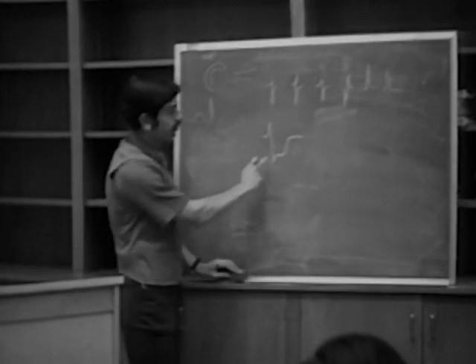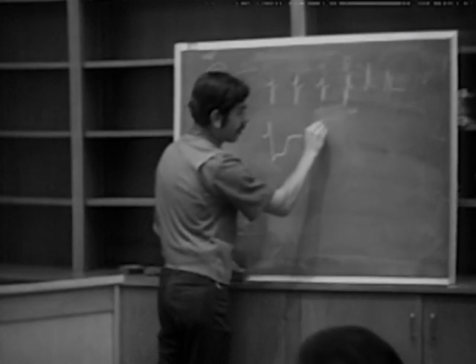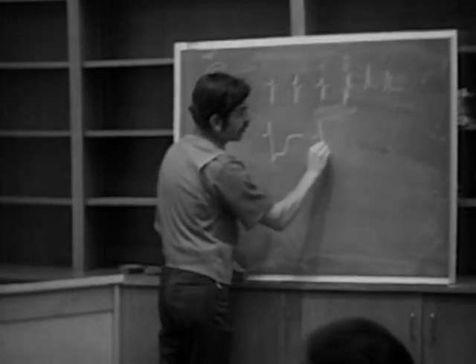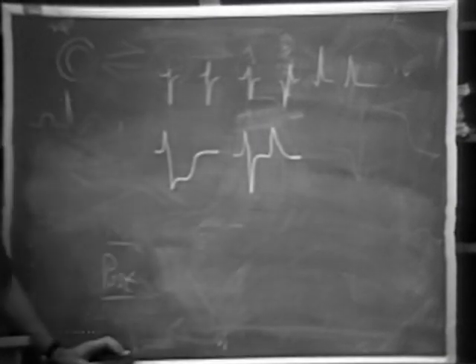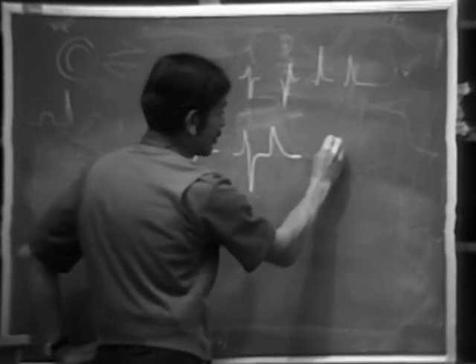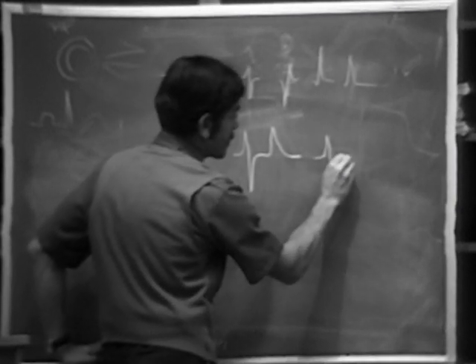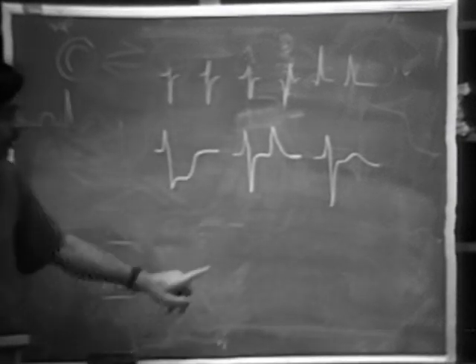Okay, so this is what happens with the acute infarct then. As this evolves, you'll still see your tall R wave. Your ST segment will return to baseline, and you'll get your upright T waves. Okay, and as this evolves further in time, this T wave may not look as prominent at all, and then you have a problem.